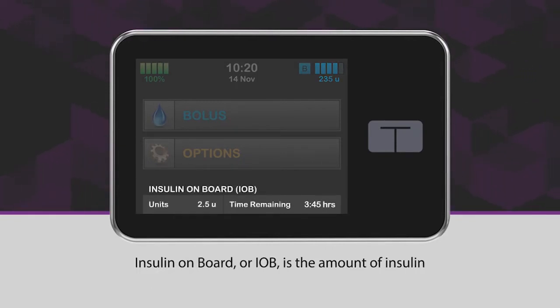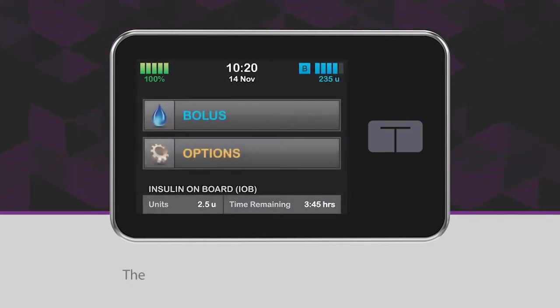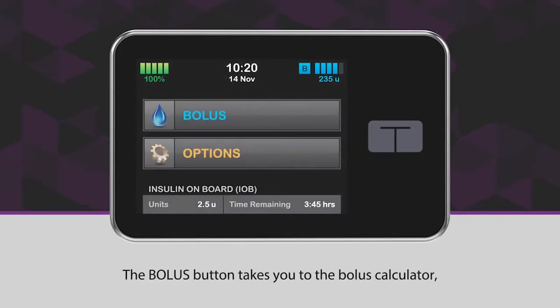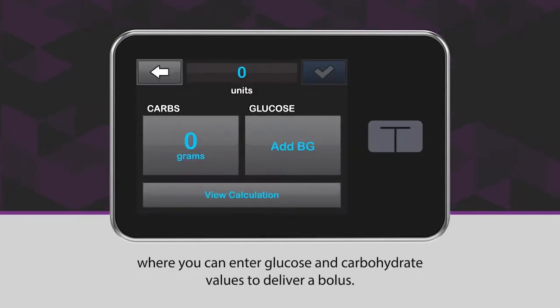Insulin on board, or IOB, is the amount of insulin still active in your body from previous boluses. The bolus button takes you to the bolus calculator, where you can enter glucose and carbohydrate values to deliver a bolus.